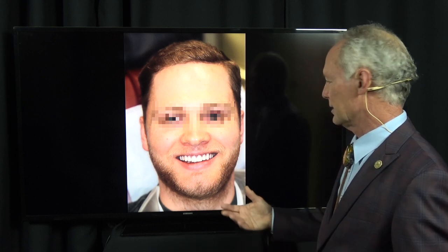And he can use the provisional model for a custom incisal guide tray or a polyvinyl siloxane matrix as a guide for the incisal plane of the final restoration. So this goes to the technician too. These are the provisionals in place.